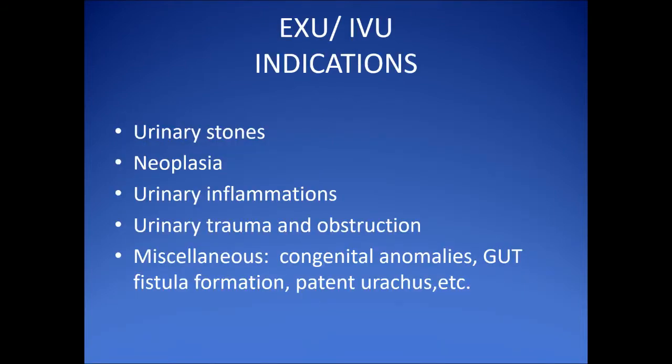So what are the indications for this imaging modality? One, if you are entertaining urolithiasis, stones which could be in the kidneys, ureters, or urinary bladder.